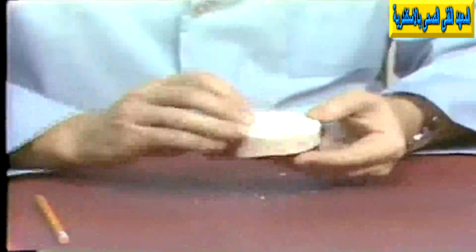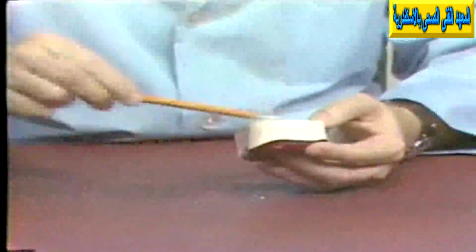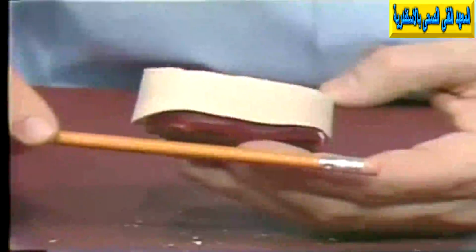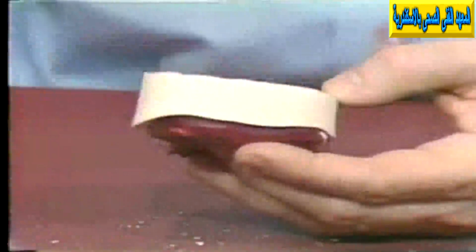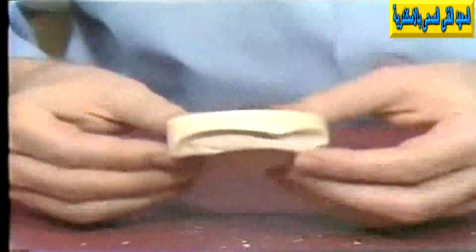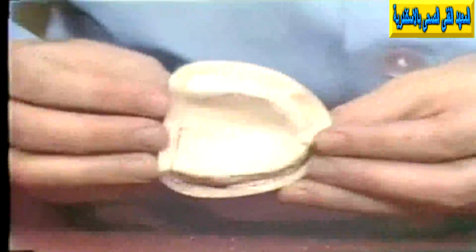The last step is to go to the model trimmer and arbitrarily make the back part, the top of the cast parallel to the residual alveolar ridges. And at this time also establish the thickness to approximately 1/2 of an inch. And at this time we will recover and finish our master cast.